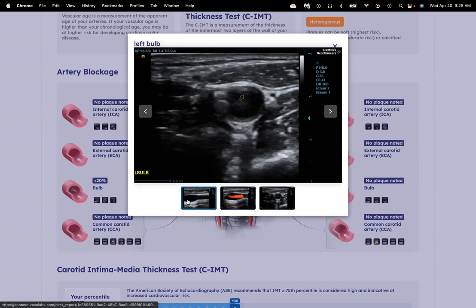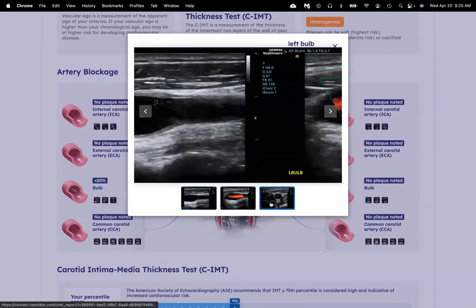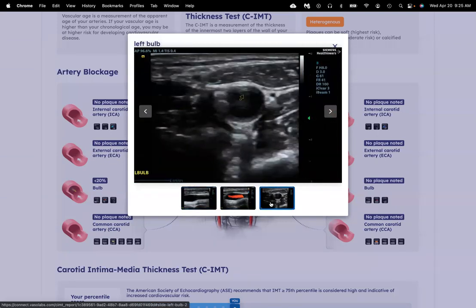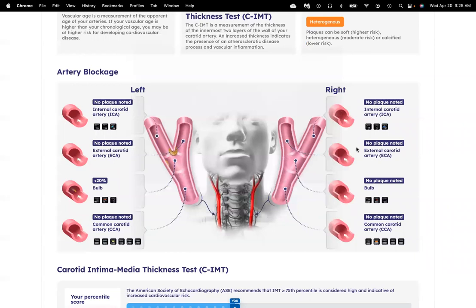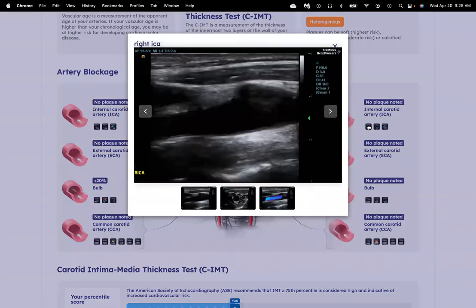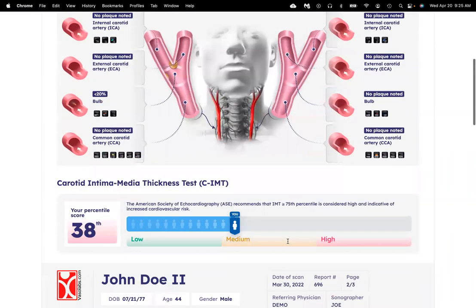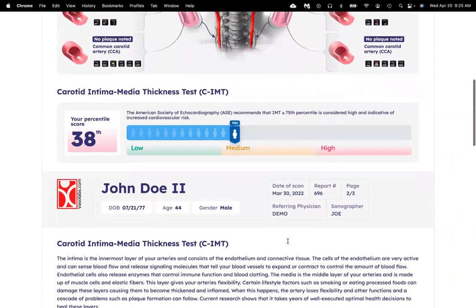There are usually three different views of each area that's measured, and the arrow will point to where the plaque is. You can do that with all of the different areas that are measured. It's kind of fun to explore.